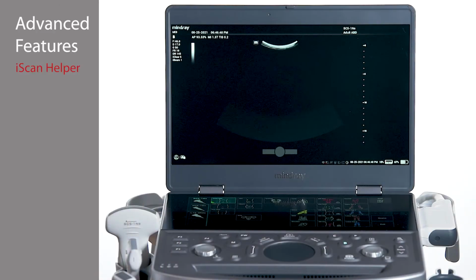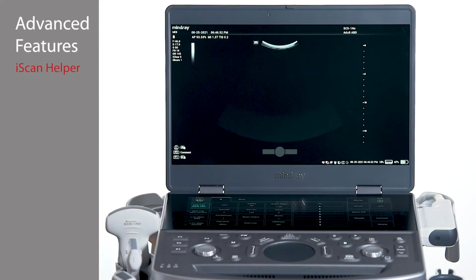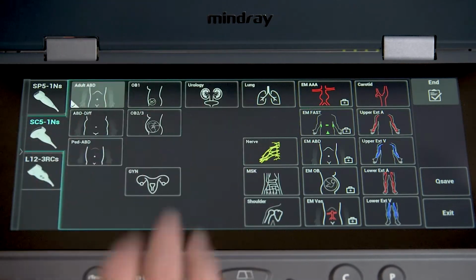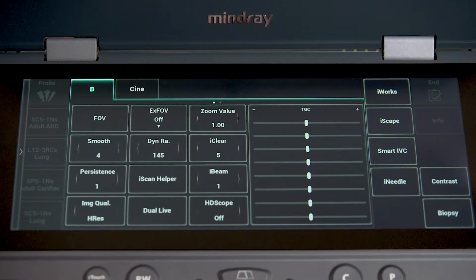iScan Helper is an educational reference tool built into the system, which provides tutorials and is exam mode specific. To initiate iScan Helper, select the desired transducer and exam mode, then tap the iScan Helper icon on the touch panel.